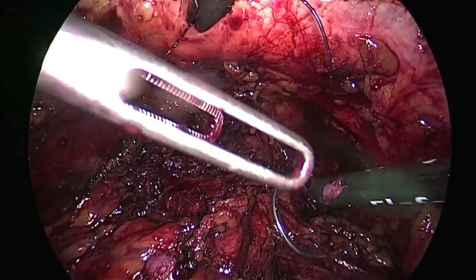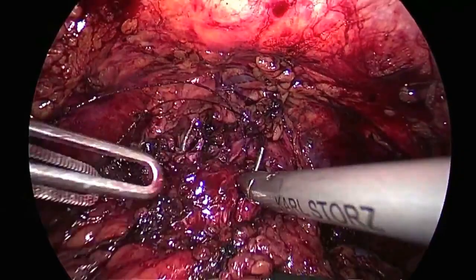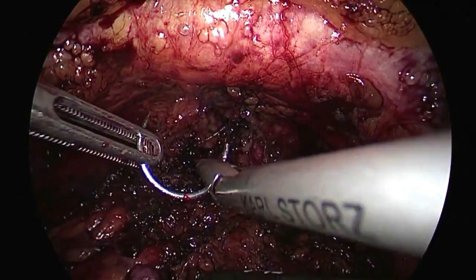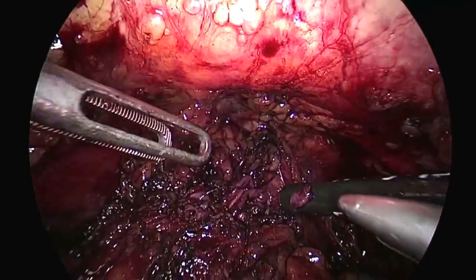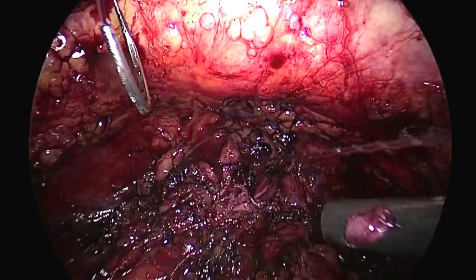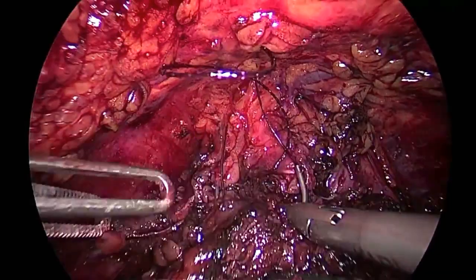Now, thanks to this kind of suture, we can reduce the operative time, and we can perform the trigonization more precisely than in the past. Okay, I would like to congratulate you for this good job and good surgery. Now I pass the last stitch and after that I stop. I knot the suture with the previous one.